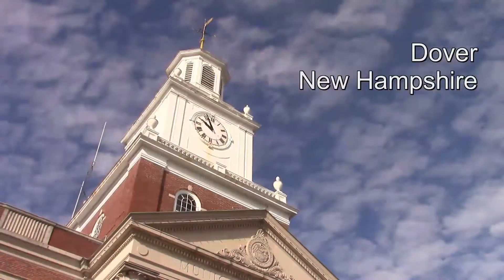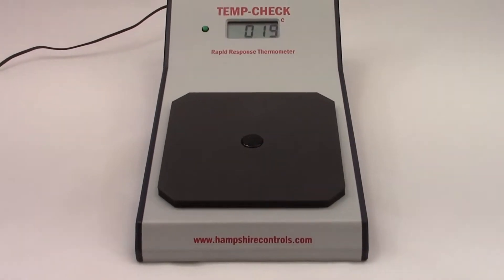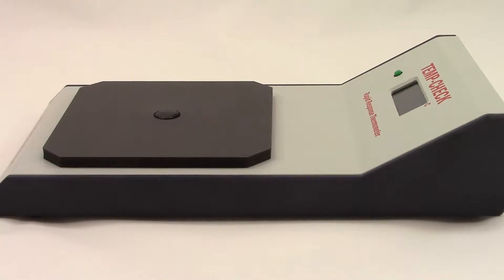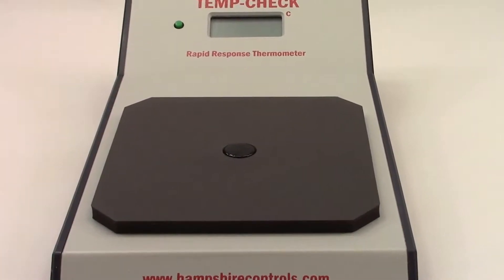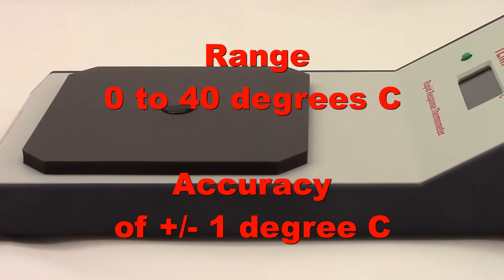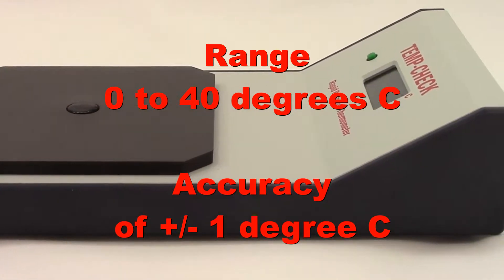Hampshire Control's TempCheck TC12 thermometer was developed to assist laboratory personnel in quickly determining the temperature of bags or containers of red blood cells, plasma, or other materials in a non-invasive manner. The TempCheck thermometer uses a fast-acting Type-K thermocouple with an insulated pad to measure the temperature within a range of 0 degrees Celsius to 40 degrees Celsius with an accuracy of plus or minus 1 degree Celsius.